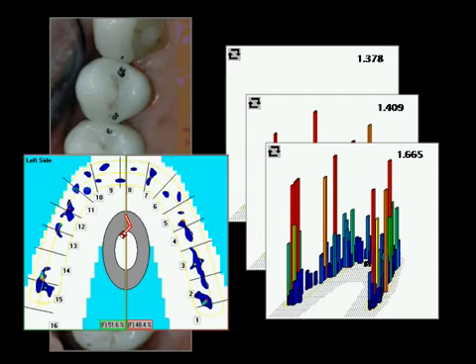third. But when I play this back, I noticed that, in fact, the patient's right side is the side that started to hit first, even though they felt the left side contact first. Which is interesting, isn't it? Because if the patient says the left side's contacting first, we're going to go to the left. And if the patient says the right side's contacting first, we're going to the right. Which means the patient, the one that knows the least about dental care, is driving the direction of the care, which to me wasn't reassuring.